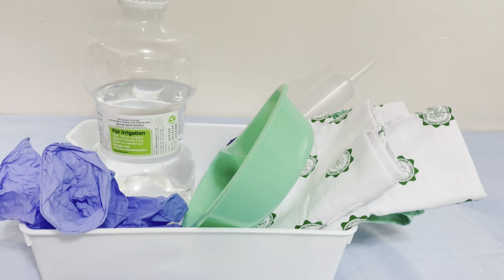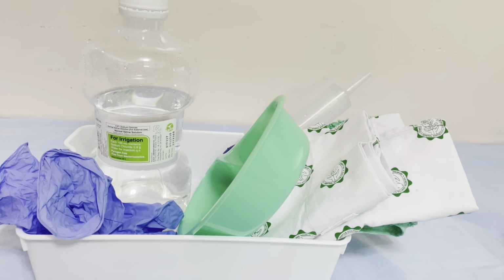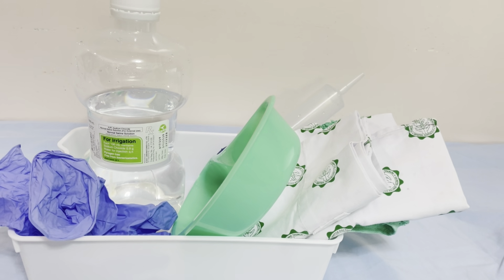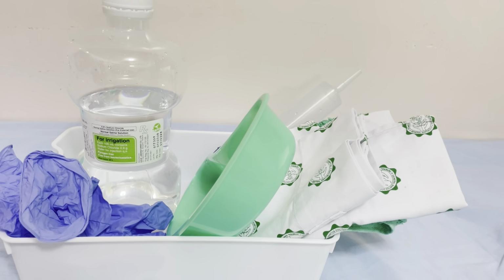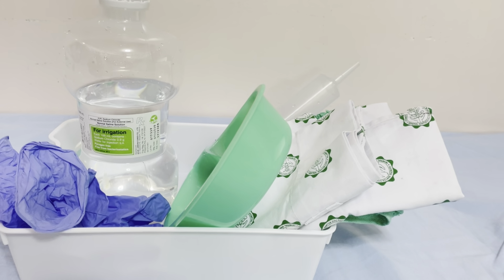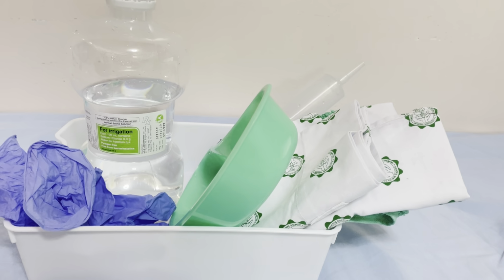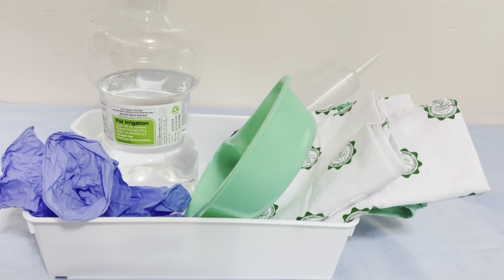We're going to need a bath towel or an underpad. We're also going to need a prescribed irrigating solution, sterile normal saline or tap water, soft bulb syringe or eyedropper, sterile basin, emesis basin, 4x4 sterile gauze pack or cotton balls, clean gloves, examination light or drop light.